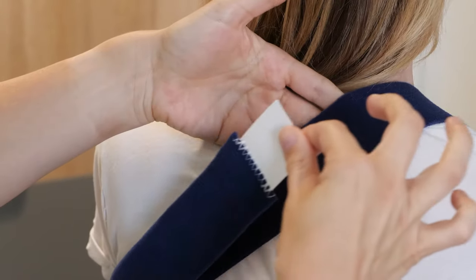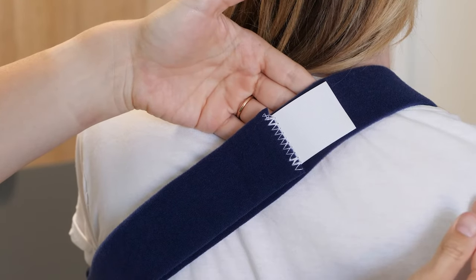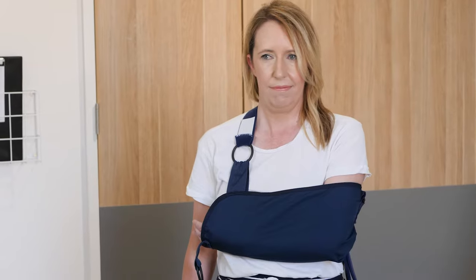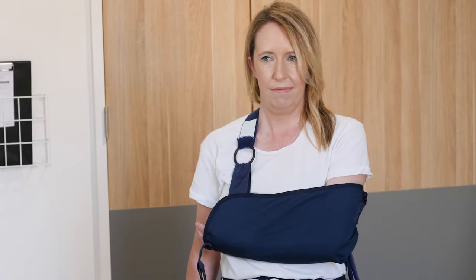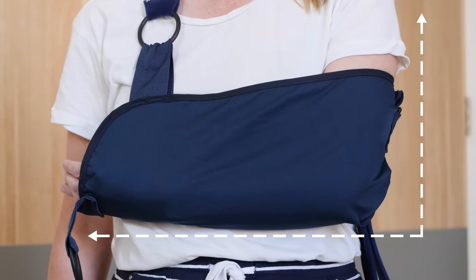If you need more support at the wrist, adjust at the wrist attachment. If you need more support at the elbow or shoulder, adjust it at the back. You will need someone to assist with this or complete the adjustment when the sling is off. Your arm should be across your stomach with your elbow at approximately 90 degrees or a right angle, with the forearm approximately horizontal.